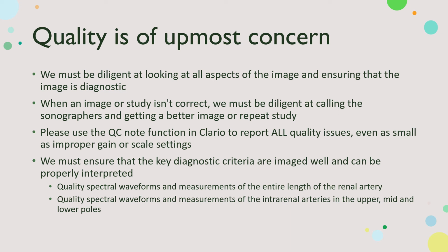I've actually asked sonographers to ask another sonographer to scan the patient, and I hate to do that, but if I don't think they're capable of doing what I need them to do, I have no problem asking another sonographer to do it. Please use the QC note function on Clario for even small technical problems like an improper gain or a scale setting. They need to know what they're doing wrong.